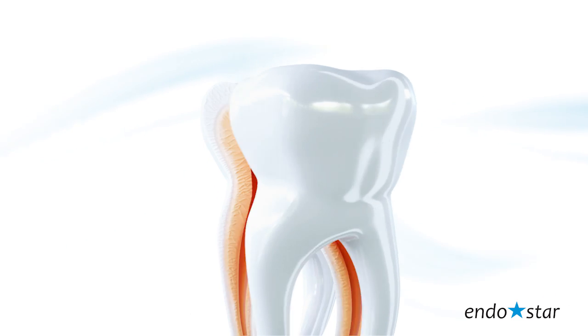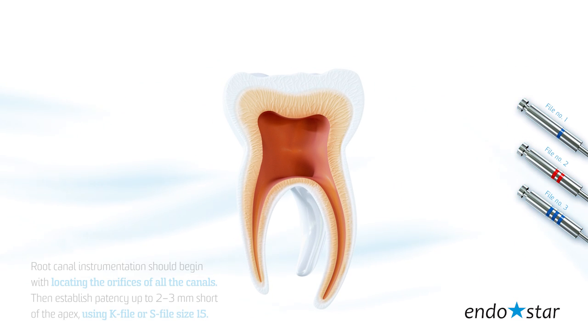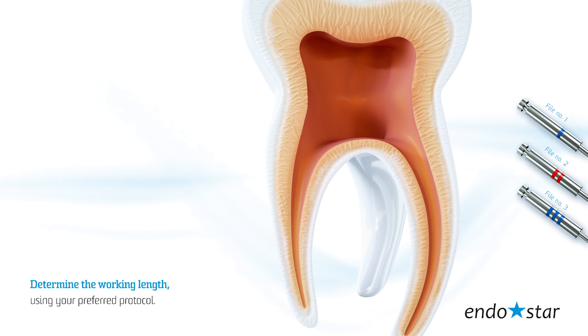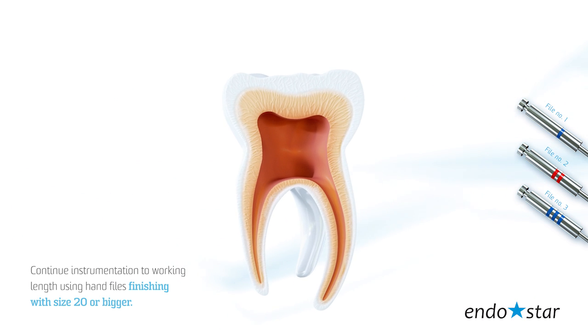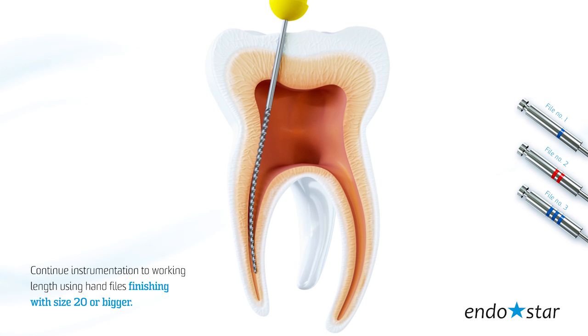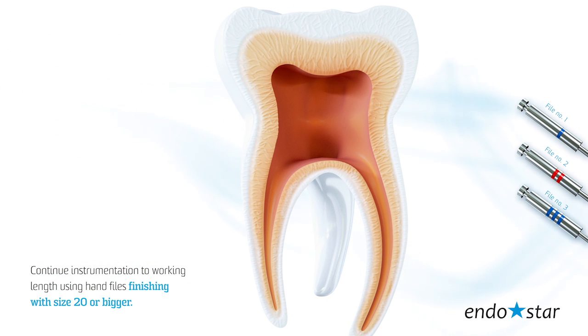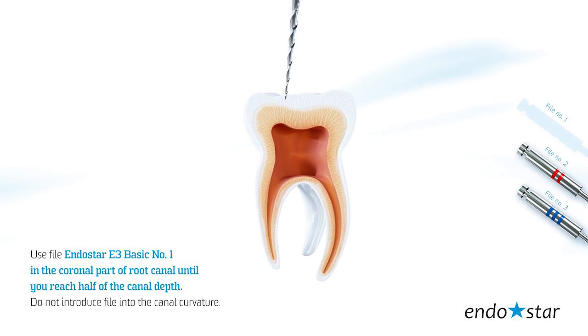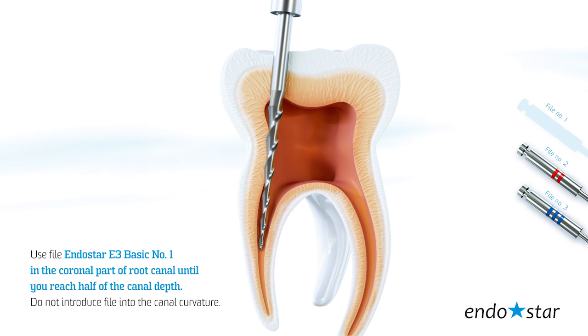Step by step. Root canal instrumentation should begin with locating the orifices of all the canals. Then, establish patency up to 2-3 mm short of the apex using K-file or S-file size 15. Determine the working length using your preferred protocol. Continue instrumentation to working length using hand-files, finishing with size 20 or bigger. Use the EndoStar E3 basic number 1 file in the coronal part of the root canal until you reach half of the canal depth.